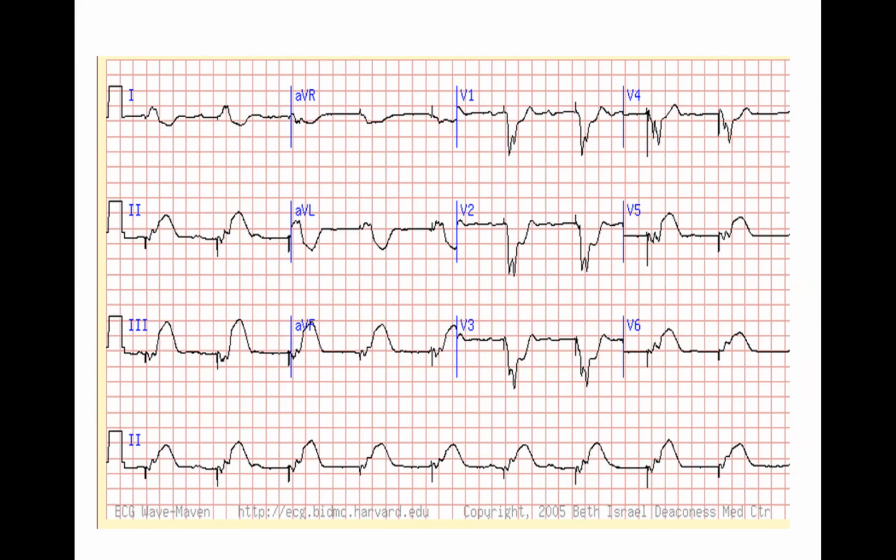It's okay. This is a 12 lead ECG. It's showing paced rhythm. This is maybe a single chamber, I think a single chamber VVI mode.